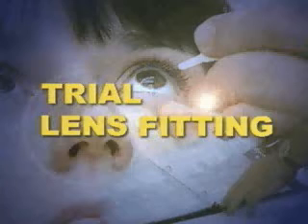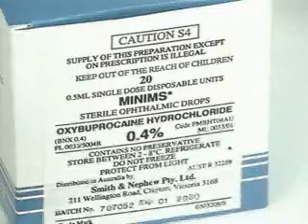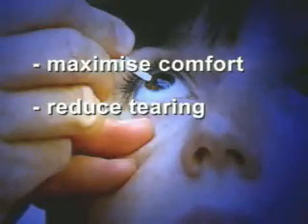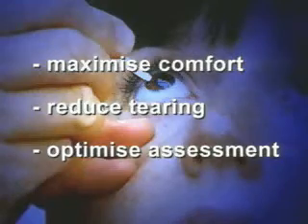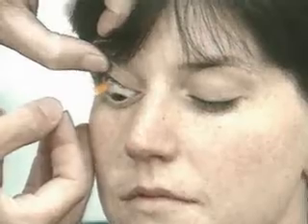Trial lens fitting. The extensive Rose K trial lens set enables even a novice practitioner to confidently fit their keratoconus patients. A short-acting, topical corneal anesthetic should be used prior to lens application on new patients. This will maximize initial comfort, reduce tearing, and optimize assessment of the fluorescein fitting pattern. After application of the lens, have the patient gently wipe away any excess tears. Then apply a small amount of sodium fluorescein on the conjunctiva and have the patient blink a few times.